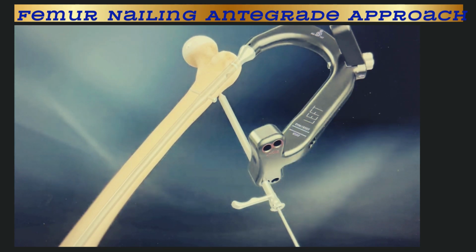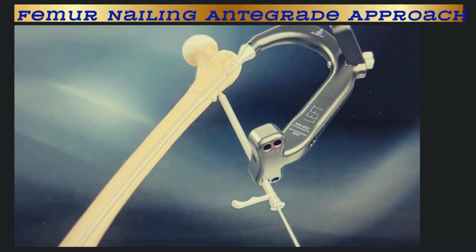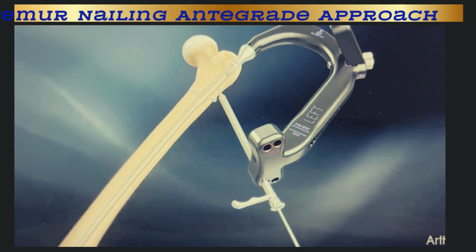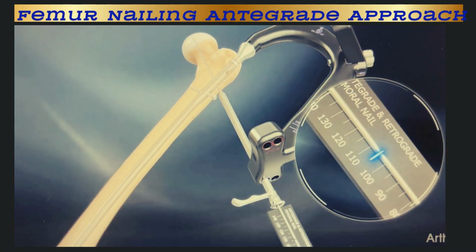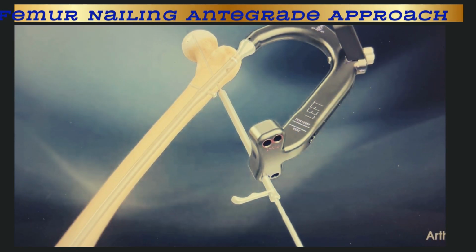Use a 3.2 mm guide pin or a solid or cannulated 5.5 mm drill bit for proximal femoral screw targeting. Then place the guide pin depth gauge over the 3.2 mm guide pin and against the pin guide. Read the required length from the depth gauge, assuring that the sheath is touching the bone.